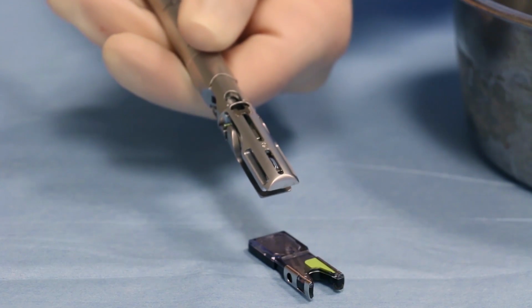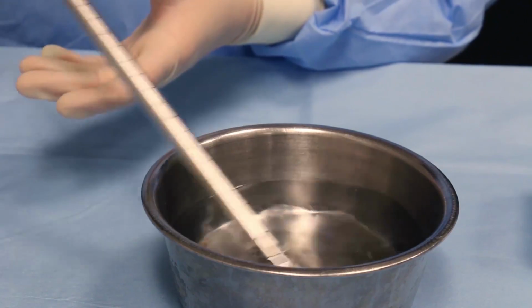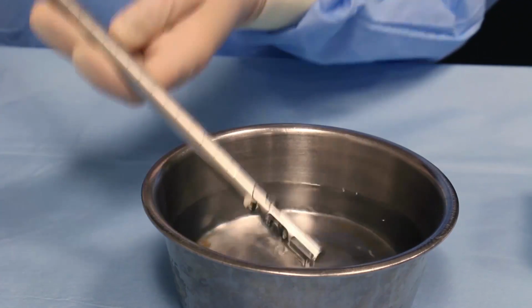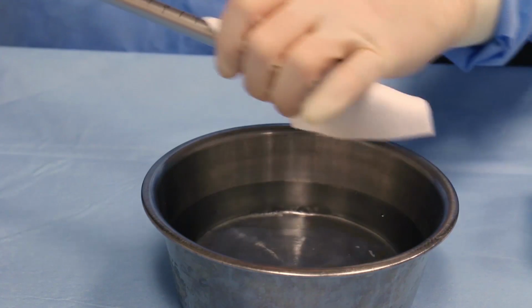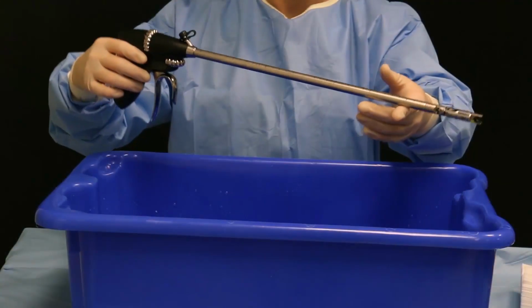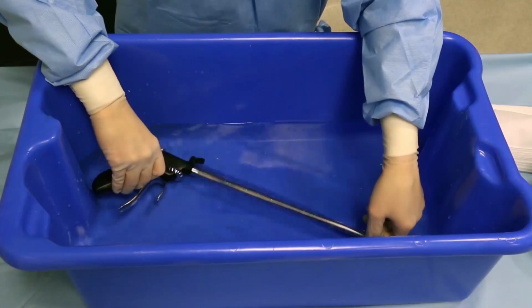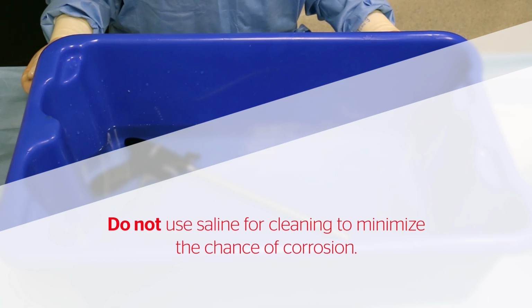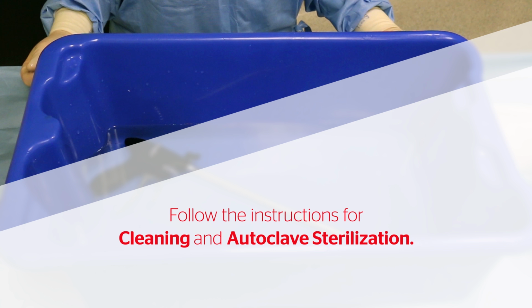If cleaning must be delayed, wet the instrument in tap or purified water to prevent drying and incrustation of soil. Remove excessive solids using disposable wipes, enzymatic foam spray, or per hospital procedure. Immerse the entire instrument in tap or purified water. Do not use saline water for cleaning to minimize the chance of corrosion. Follow the instructions for cleaning and autoclave sterilization.